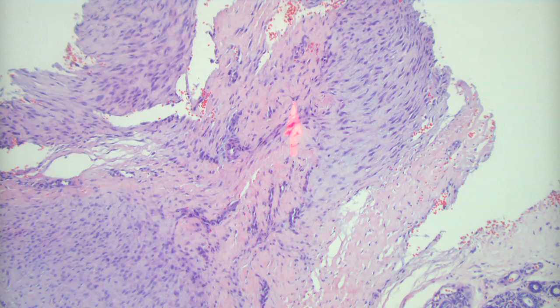So I think you got a couple of pictures. This one was plantar fibromatosis. You wouldn't know that, but it could be palmar fibromatosis. So you should learn about those, just know what they are. They're totally benign. They usually have a very bland morphology to the cells, like you saw here. They can be a problem when they go deep, like if they're a desmoid tumor and they get into the brachial plexus or something like that.